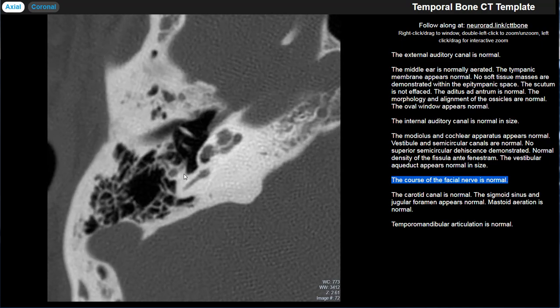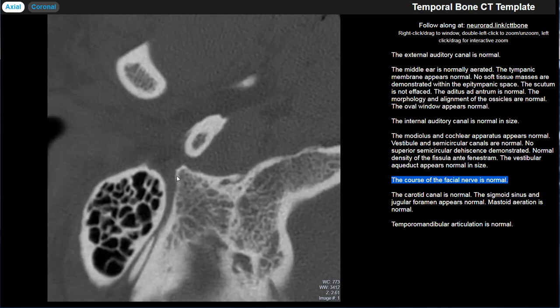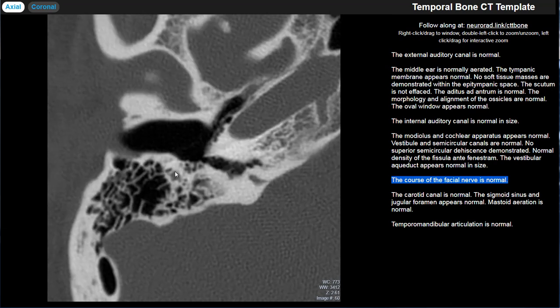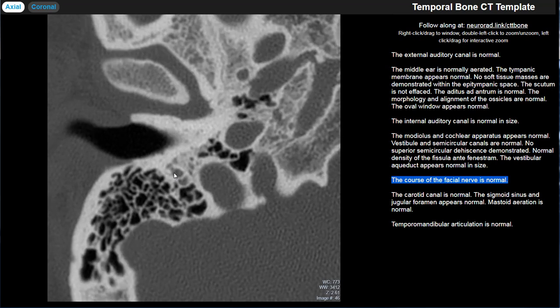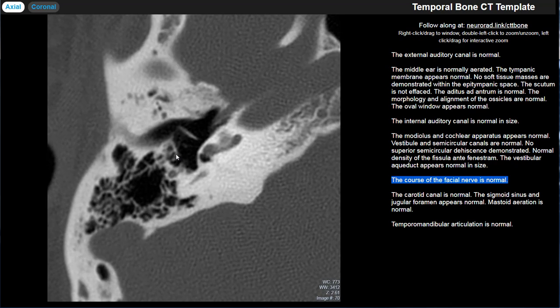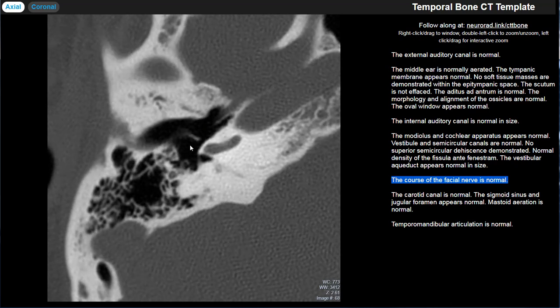As a bonus structure, occasionally you can make out a small structure coming off the facial nerve that courses superiorly and enters the middle ear — on this study you can see a tiny wisp of it. That's the chorda tympani nerve. It courses between the malleus and the incus and exits through the petrotympanic fissure to join the lingual nerve and supply taste from the anterior two-thirds of the tongue.